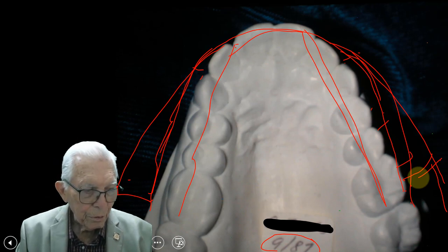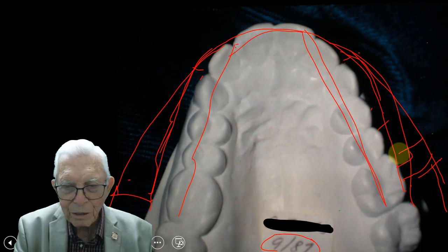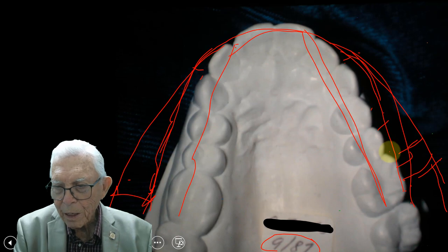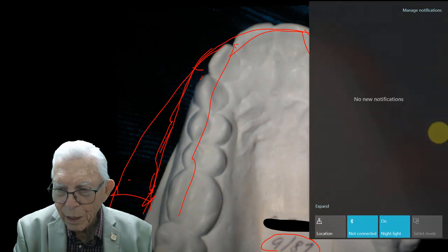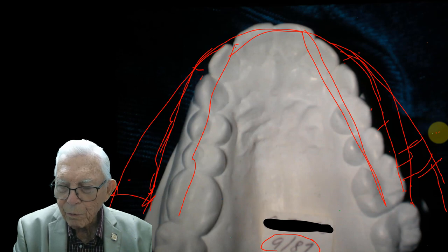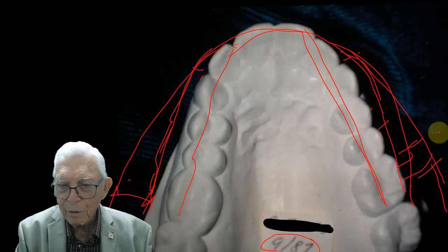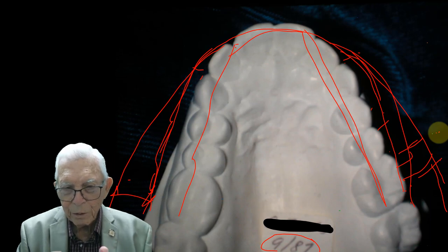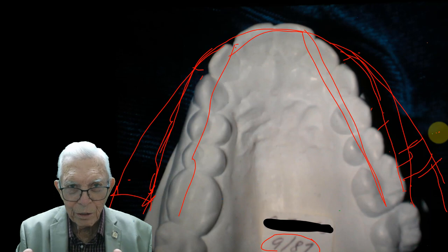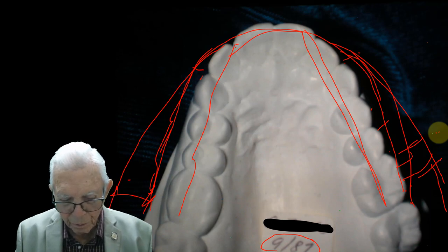If you want to measure how far it goes in there, use your force gauge and you can push on this and find out exactly how much force this has. You hook one side up, then push the other one down, and when you put it over there, it'll be half that much on each side of the mouth. So it winds it and you can tell exactly how much force you've got in there.